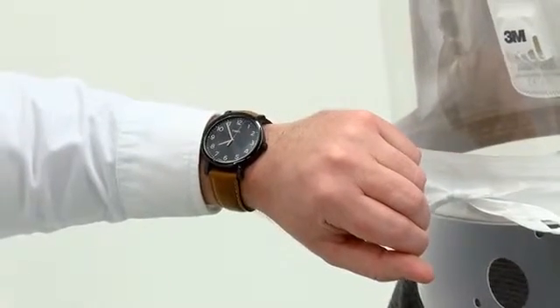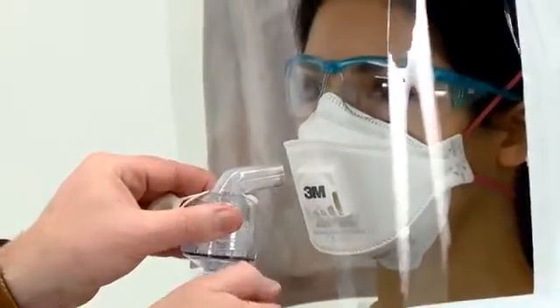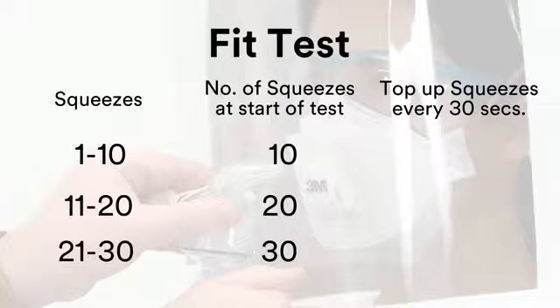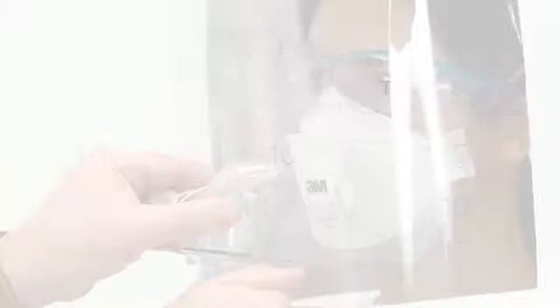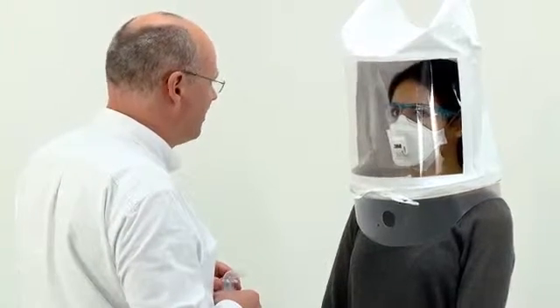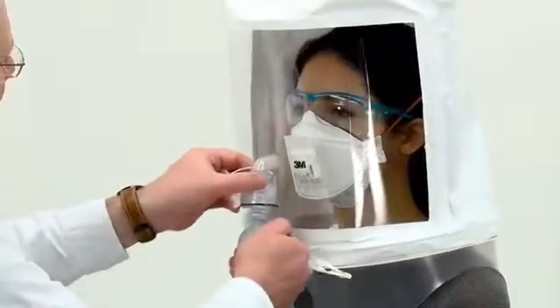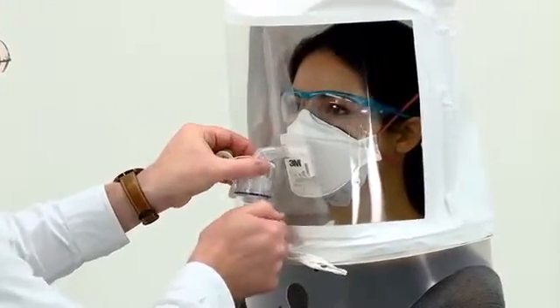There is a tendency for the mist to settle out of the hood. To maintain an adequate concentration of mist during the test, inject half the number of squeezes every 30 seconds for the duration of the fit test procedure, i.e. 5, 10 or 15 squeezes. After one minute of normal breathing, ask the subject to start deep breathing, taking care not to hyperventilate, and remember to top up the concentration every 30 seconds.